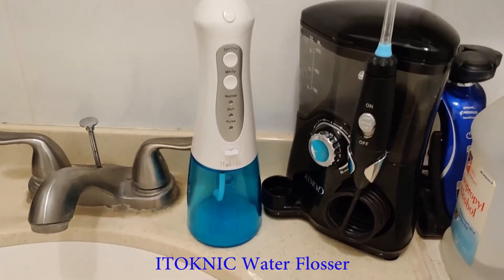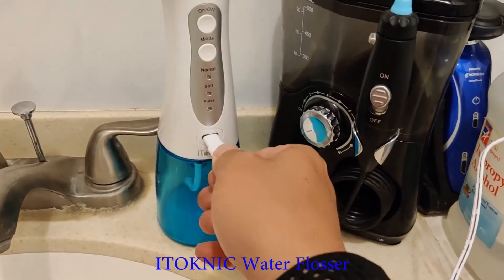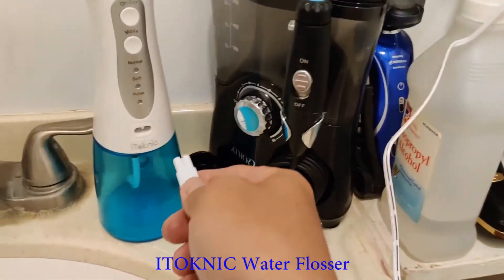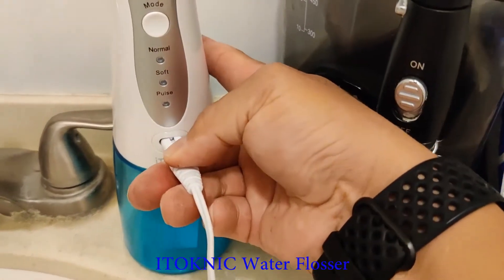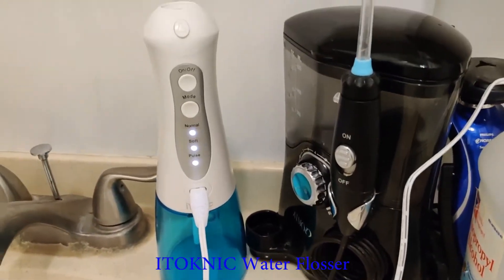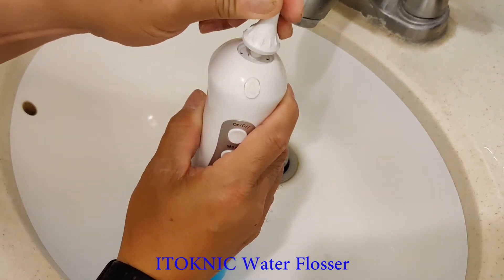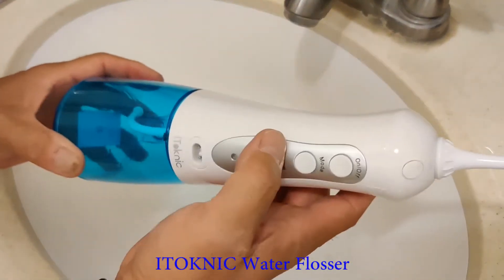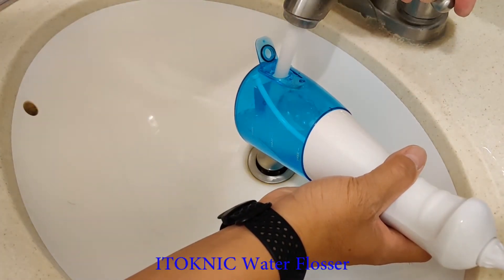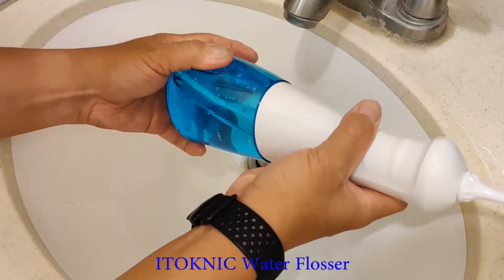Alright, let's get this thing plugged in, charged up, and see how well it works. The tip just goes right in here, and water goes in here. Okay, plenty of water.